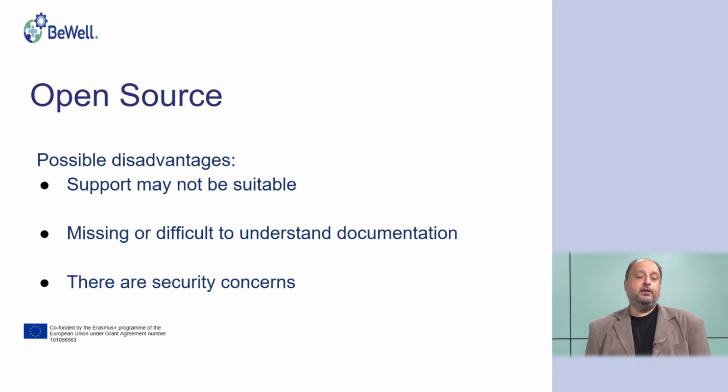Also, because there are many people that develop open source software, sometimes there is a lack of documentation, or the documentation is written in such a way that it is difficult to understand, because IT experts and health professionals speak in different languages. So it is not very easy to understand each other.